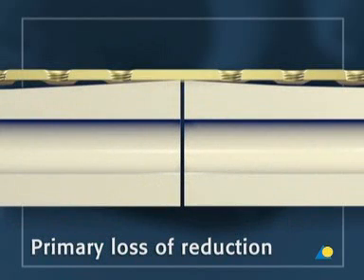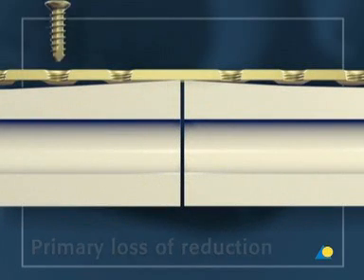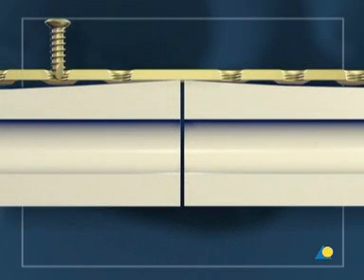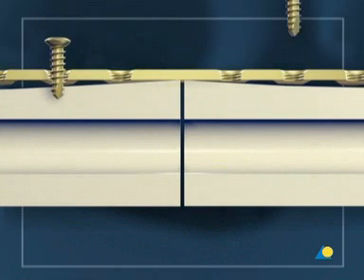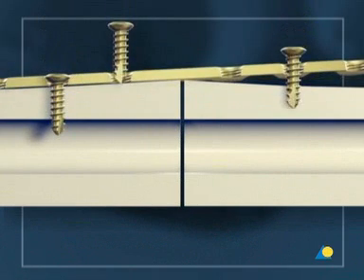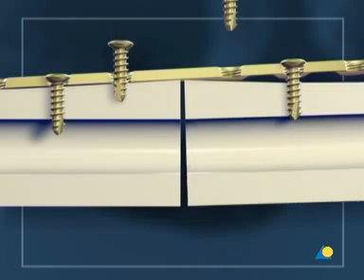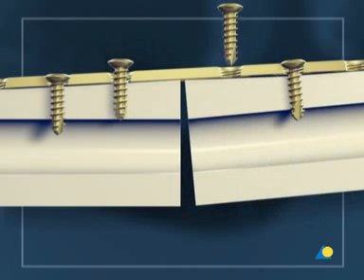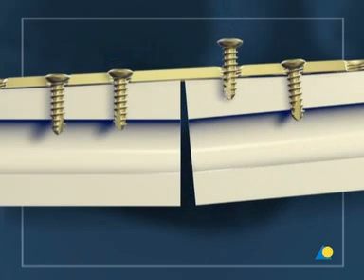Primary Loss of Reduction: When using conventional screws, it's essential to contour the plate precisely to the bone surface. Otherwise, the tightening of the screws will lead to a primary loss of reduction.